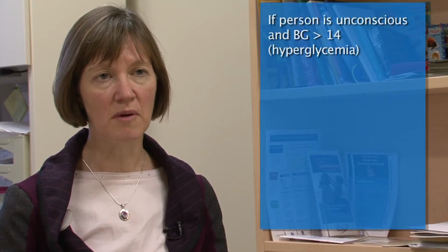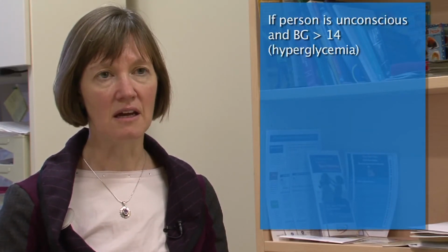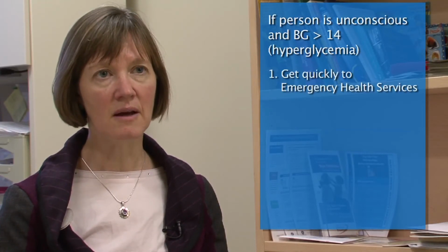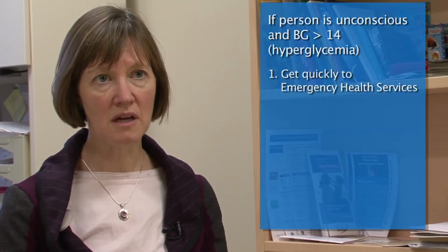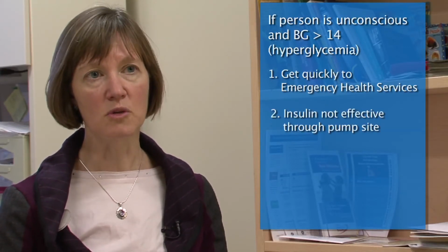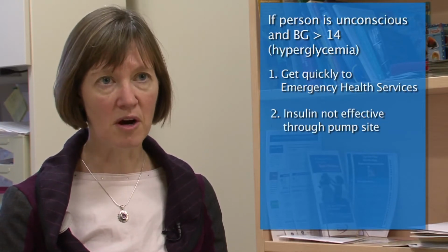So if the person is unconscious and we know that the blood sugar is high or above 14, then the important thing is that they need to get quickly to emergency health services. They need insulin, but putting insulin through that pump site is not going to be effective, and it shouldn't be the route that you go. The most important thing is to get them to emergency services, like an emergency department, as soon as possible.